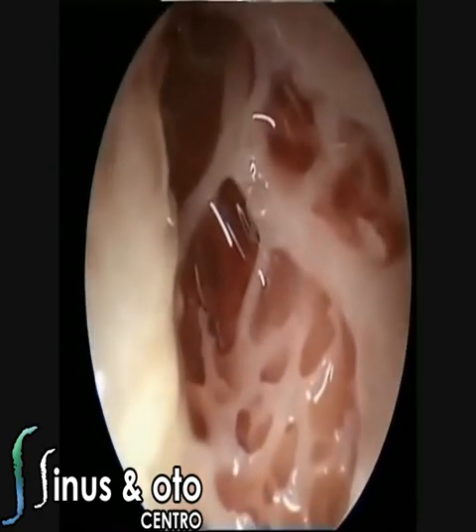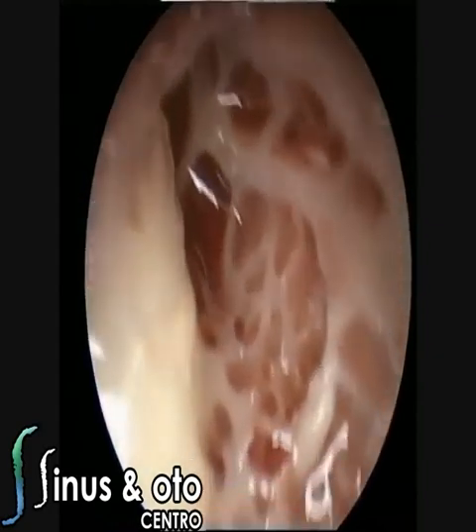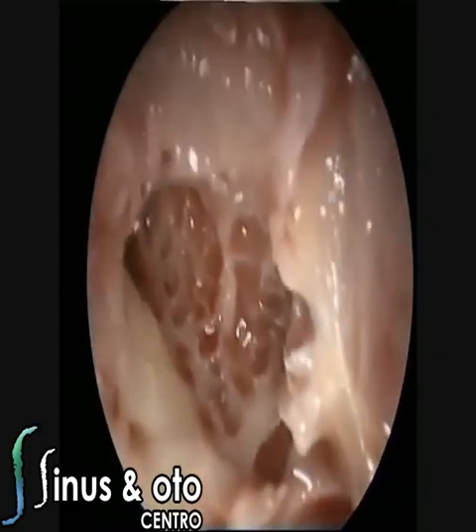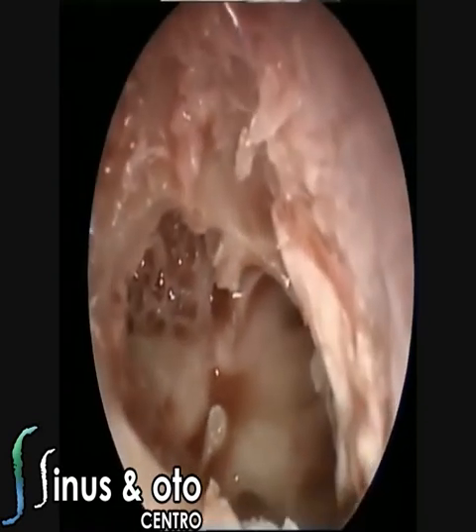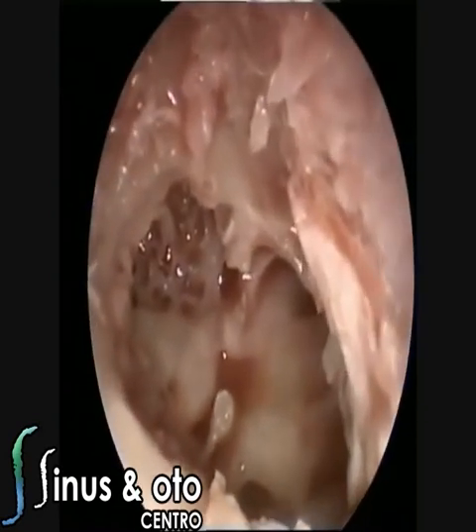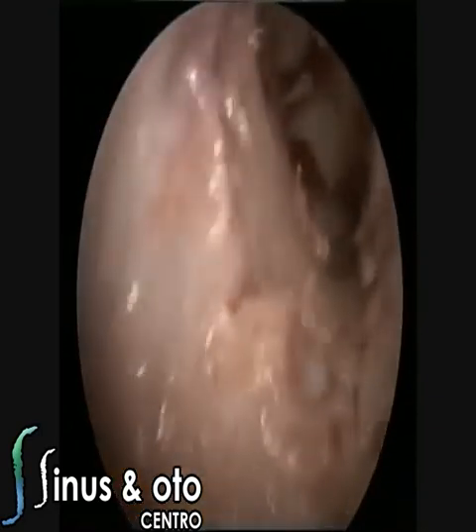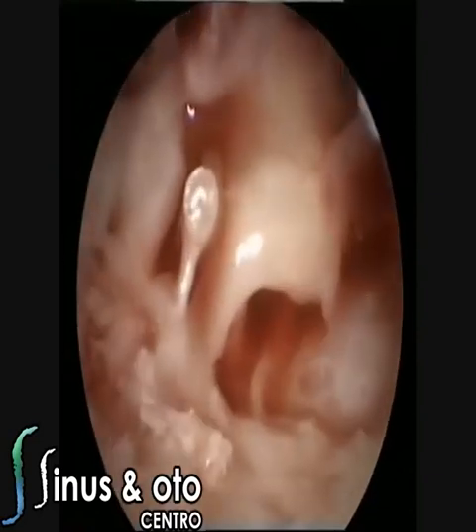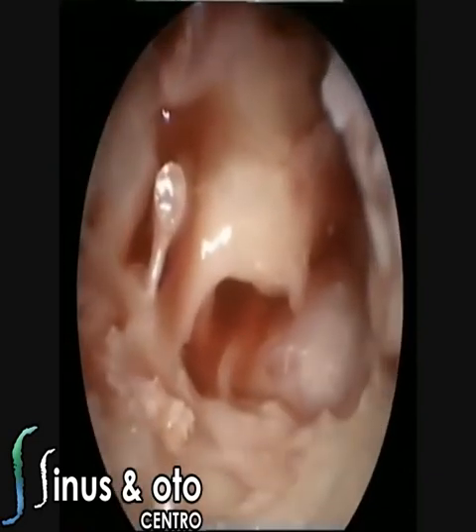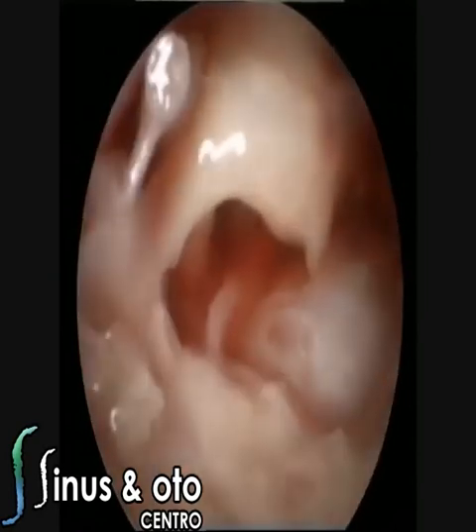This is an angled endoscope, a 45-degree endoscope, and we are inspecting the mastoid antrum. As you can see, the lateral semicircular canal. The superior part is the tegmen, and of course you saw the mastoid antrum. In this picture you can see the anterior part, the eustachian tube, and of course using the angled endoscope you can inspect a little bit better the facial recess, which is no longer a recess anymore when you do this endoscopic approach, and the sinus tympani over there.